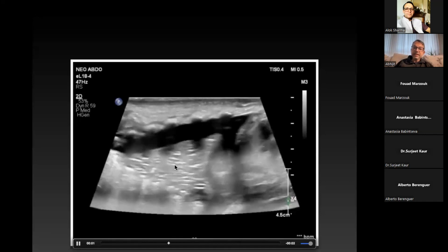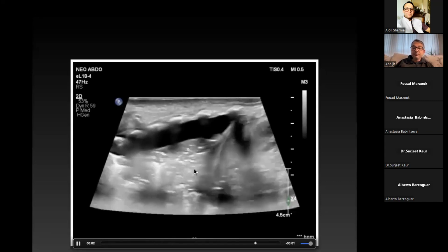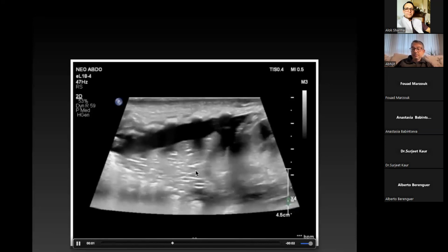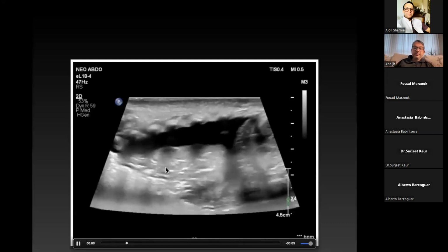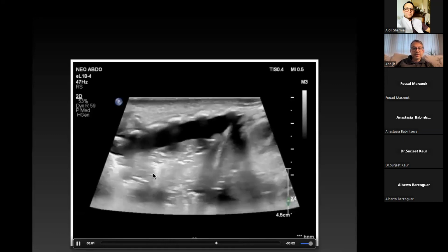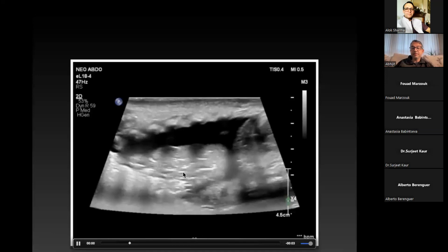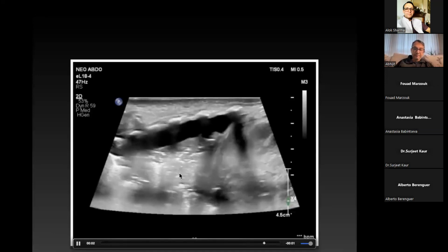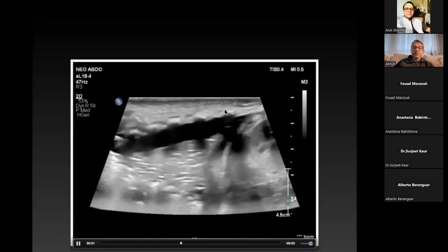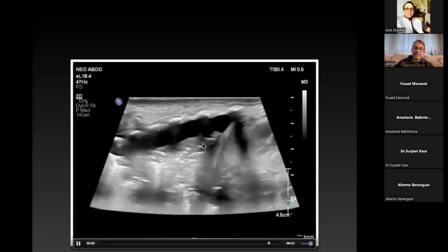There is not much fluid in this lung, as this must have been filled with the fibrinous strands in the pneumonia. So quite an advanced pneumonia there. So you don't see air filled bronchograms. You can definitely see some over here, but in all these areas, it's just coming up as a white speckle as the baby tries to breathe in air. And again, if you focus on this particular area, you will see the jellyfish sign and the curtain sign as well.